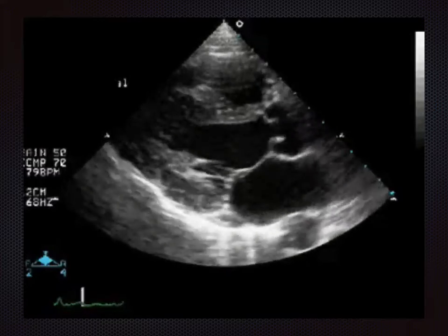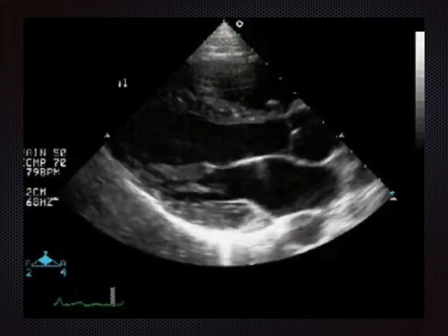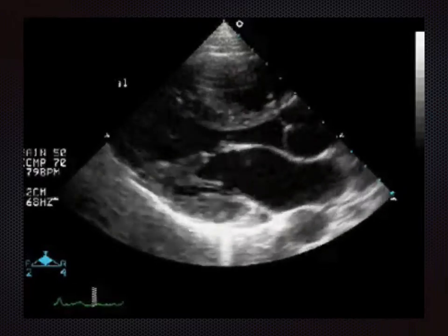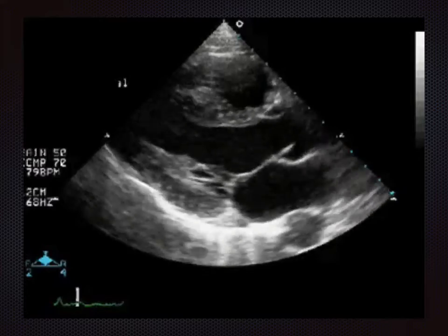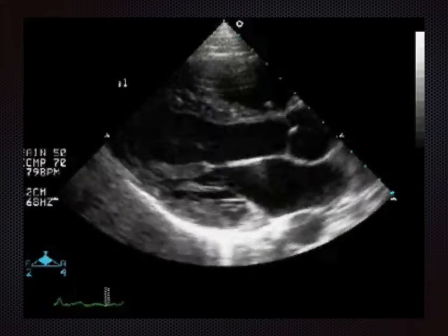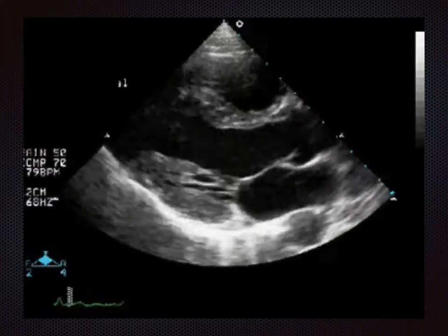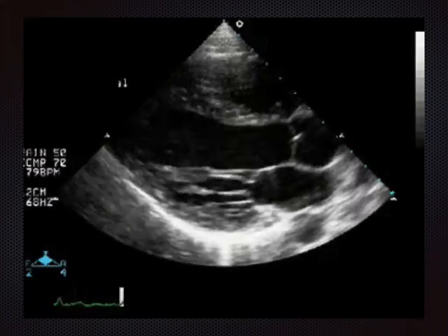So it's not the whole part of the right ventricle, it's just a small part of it that's seen on this view. Other things to note is at the bottom of the screen, on the right, is a round black structure below the left atrium. This is actually the descending thoracic aorta. So it's the aorta that's gone around the arch and is on its way down.